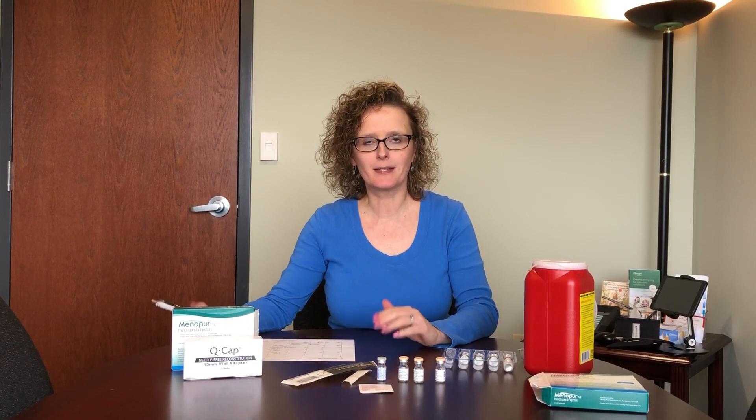Hi, my name is Julie Coffey. I'm here at Fertility and Endocrine Associates. I'm going to teach you how to mix Menopur today for your IVF.